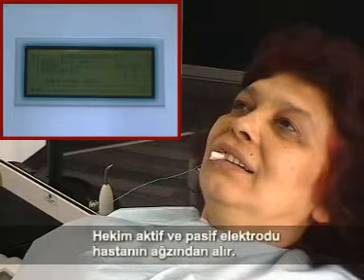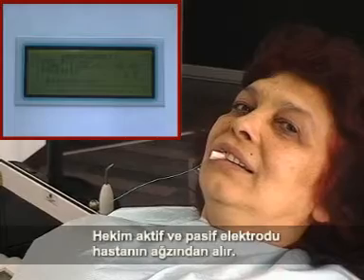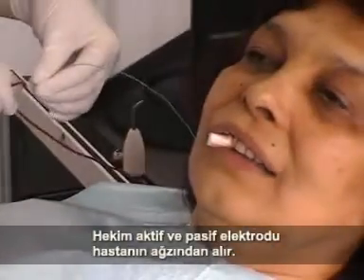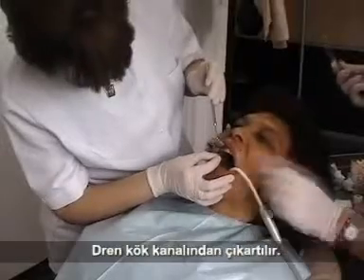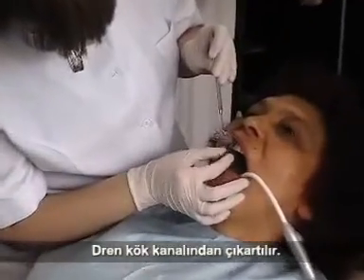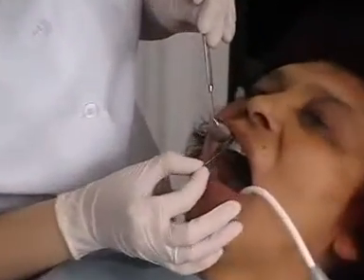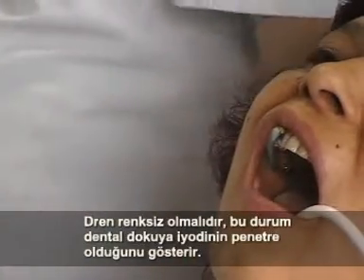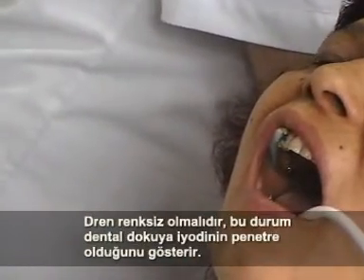The dentist removes the device's active and passive electrode from the patient. The drain is taken out of the tooth canal. The drain must be colorless, and this indicates iodine penetration in the dental tissue.